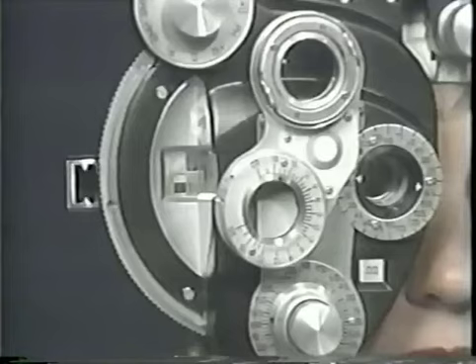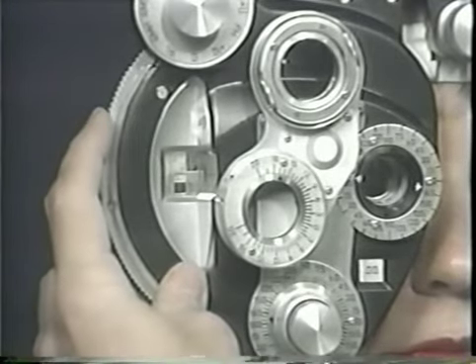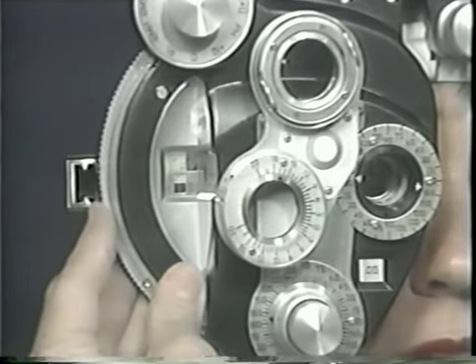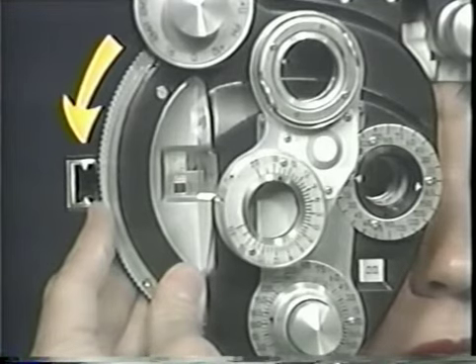Let's watch. Good. Now watch closely. I'm going to change it. Does this make it better or worse? Ready? There. Notice that sphere is always changed first in the plus direction by dialing down on the sphere dial. This pulls the focal lines or focal point forward, tending to relax accommodation.